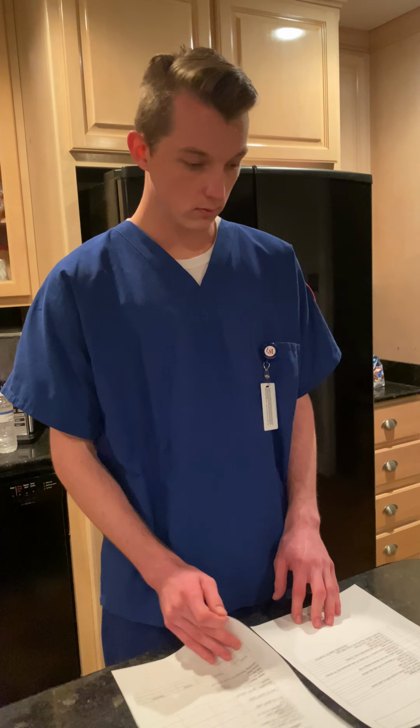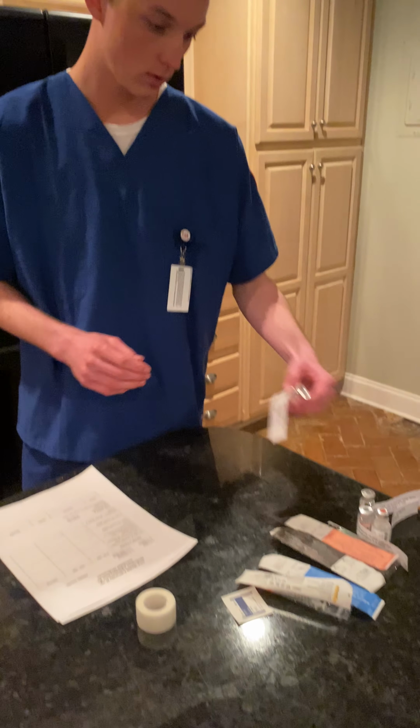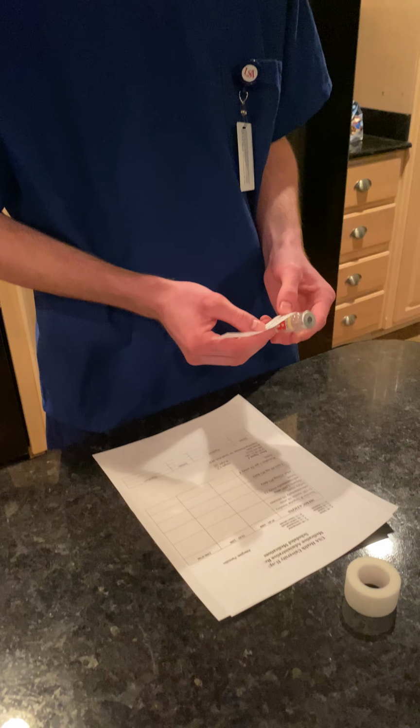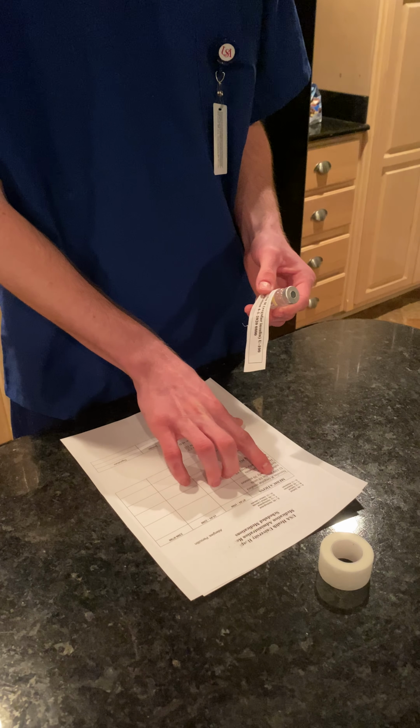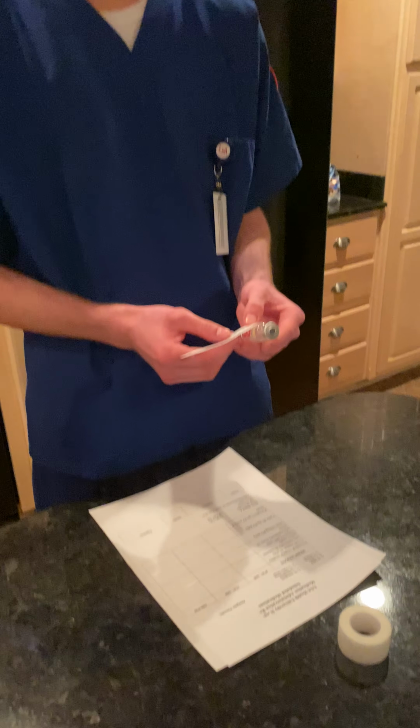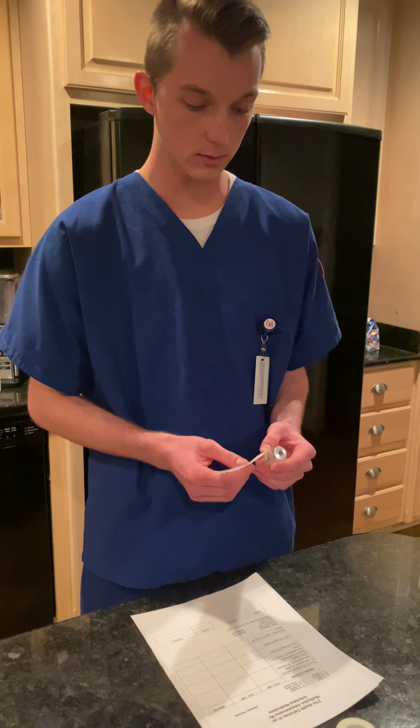So now I will perform hand hygiene and select the correct medication. So I have Novolin R regular insulin. The expiration date is 4/1/20, so it is not expired yet.